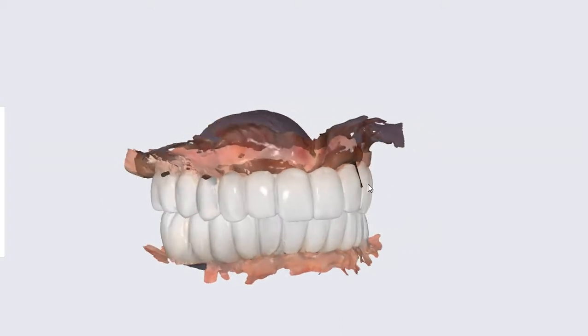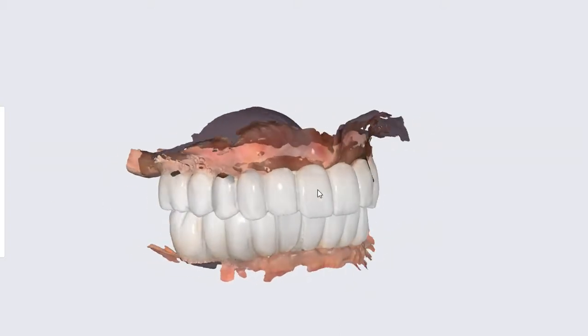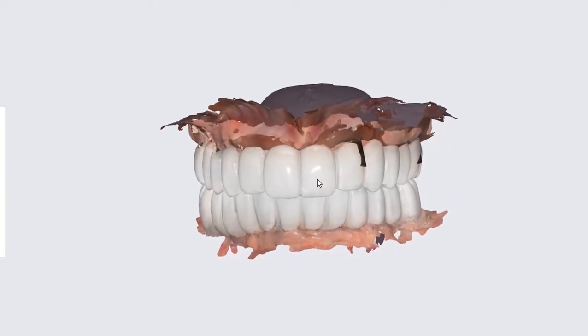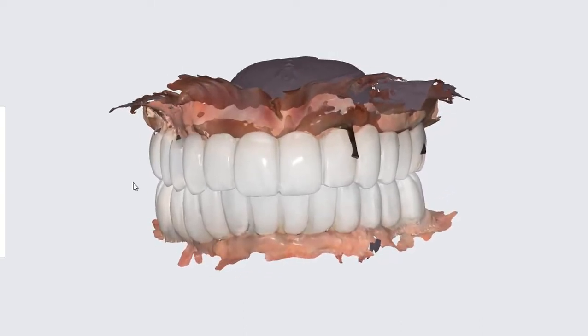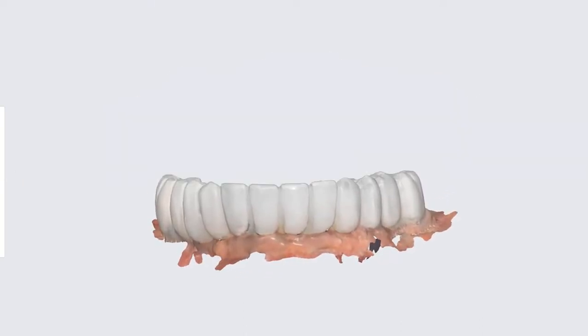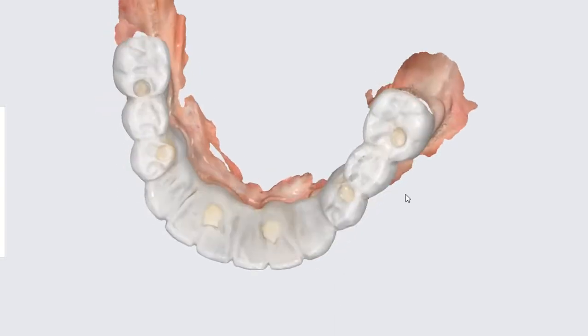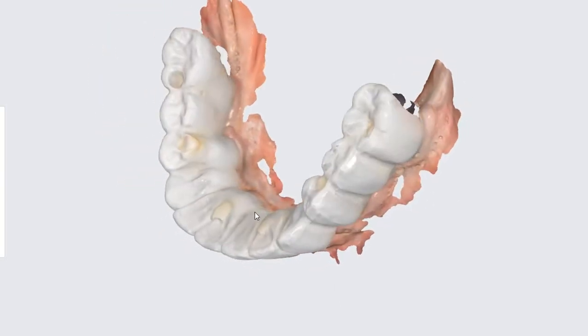To restore a full upper and lower arch that's currently in temporaries, when you're in the provisional phase looking to go to finals, I'll scan the upper arch and the lower arch with any changes to the occlusion that are made, or if the patient thinks it's too thick.